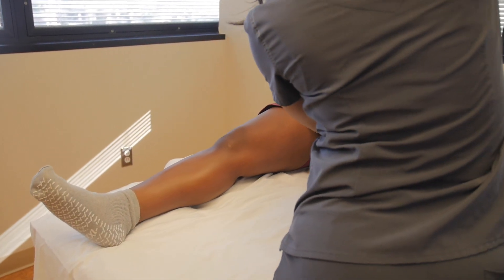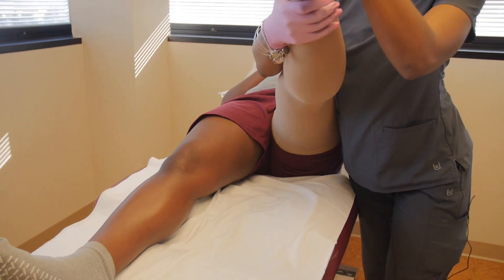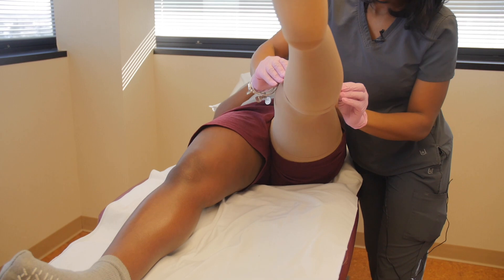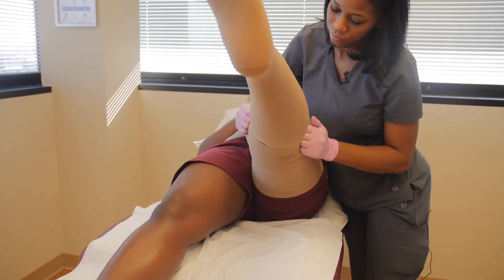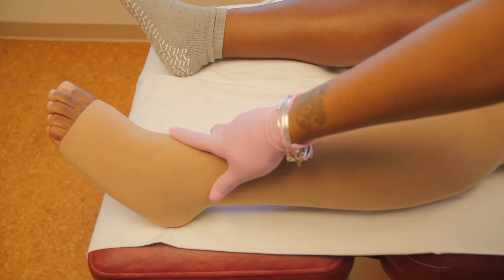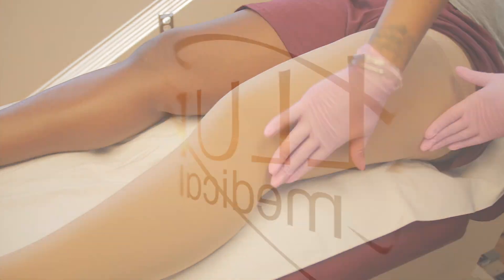I just bring the patient's leg up just a little bit more. And then after that, I kind of adjust a little bit more to give them that comfortable feel, just making sure it's smooth with no bunching. You don't want any creases in your stocking at all.